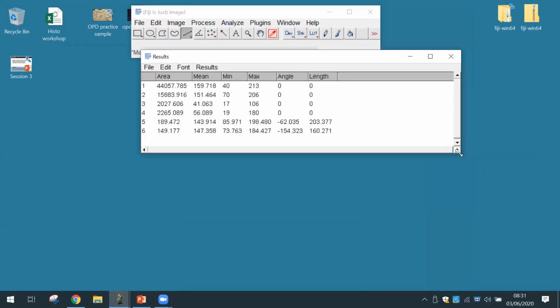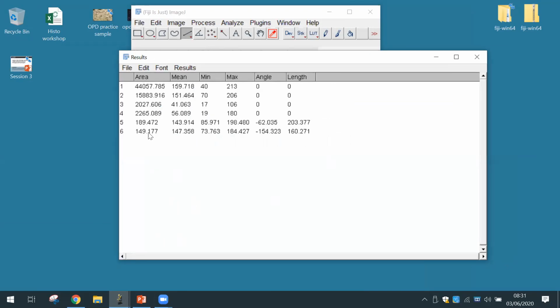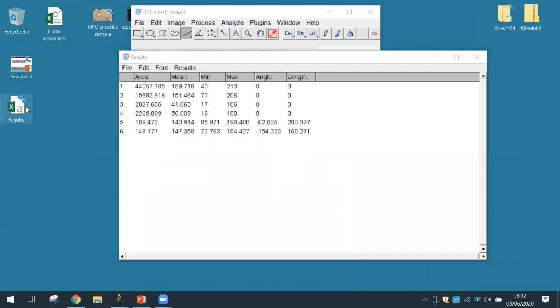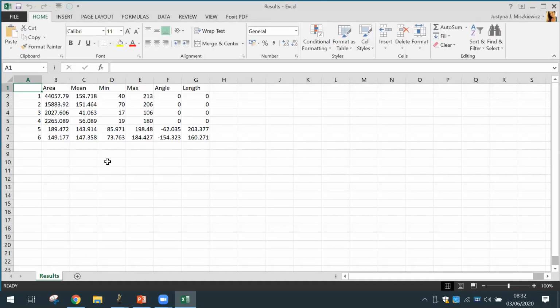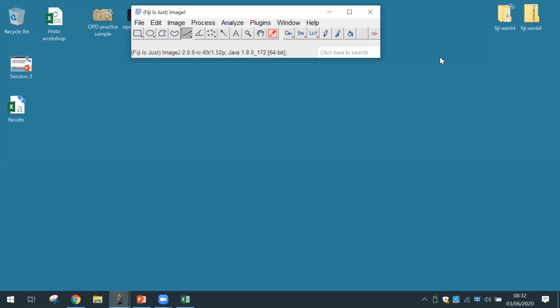And so like I was saying, if you continue doing this for several osteon structures and several images, you'll start building up a big data set. Those of you who are not aware, you can actually save the ImageJ output as an Excel spreadsheet. So you just click File, Save As, on your desktop. And then it basically becomes your raw data.